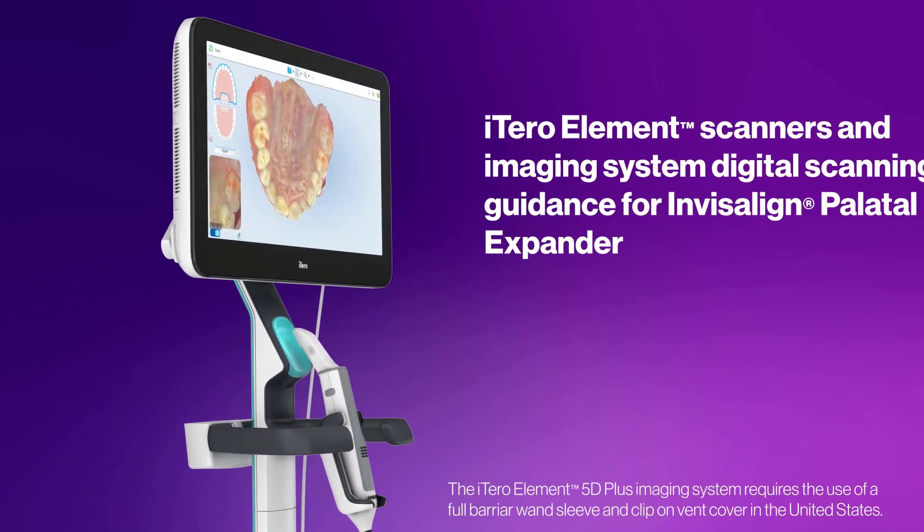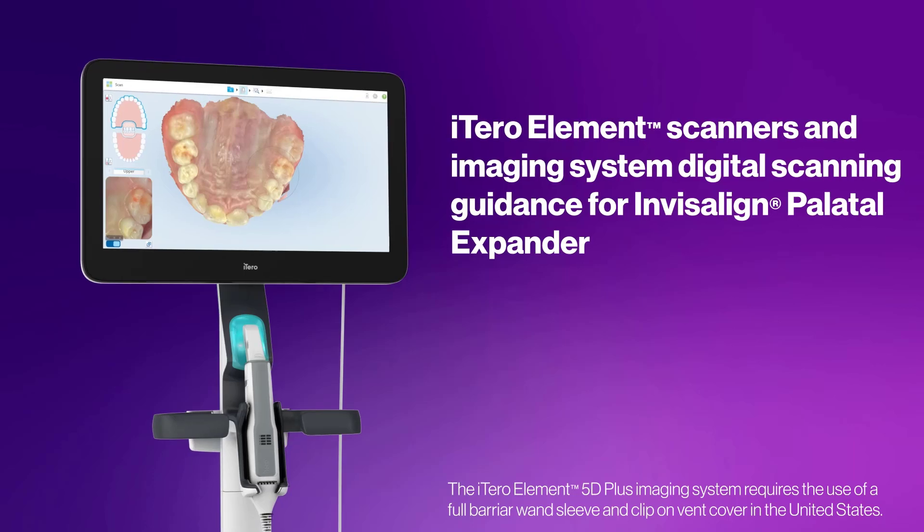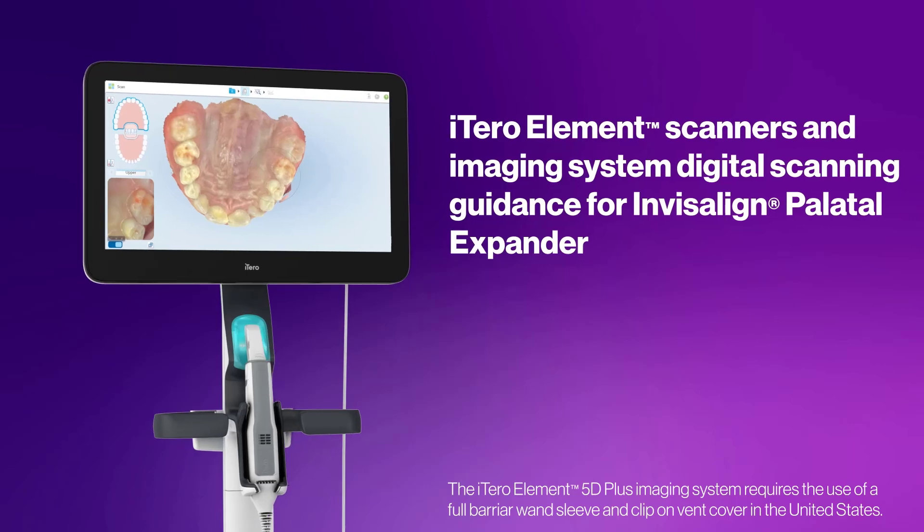In this video you will learn how to scan patients for the Invisalign Palatal Expander system using the iTero element scanners and imaging system.